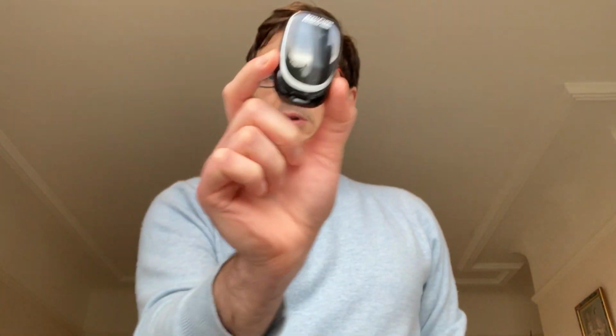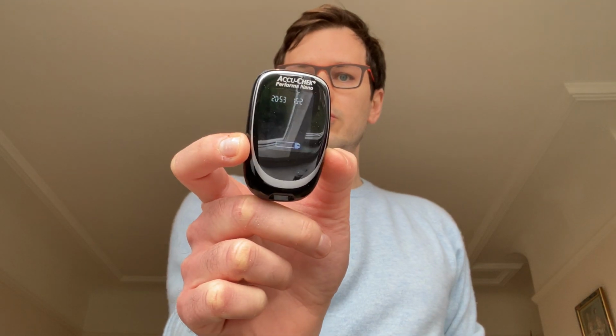In previous years, usually I would let a student stab me, but because of the social distancing rules, we are not allowed to do this here. So I will have to do it myself. We will have a few things today. We have the glucose reader, which is already on and will give us a readout of the concentration of glucose in my blood.